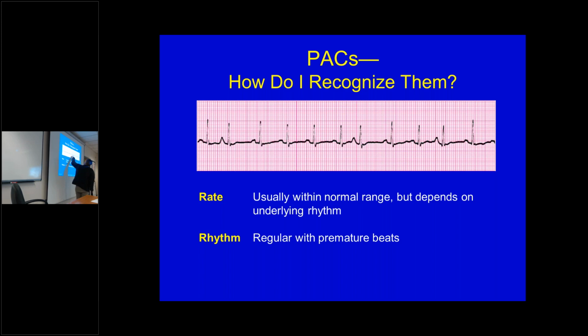That P wave's different. Come back here and be like, oh, well, if that P wave's different, then that's a shorter beat than where it should be. Because this distance is the same as what it would be if it was regular, right? It's just that middle one beat a little bit closer. If it was right there where it should be, it would follow the same pattern. Does that make sense? So the two R's is that same distance. Which notch? Towards the right. Right there, yeah.